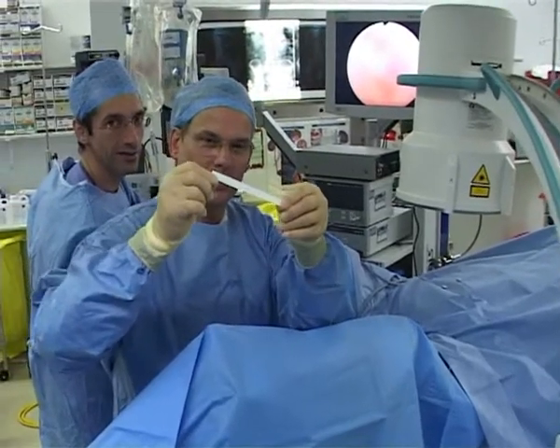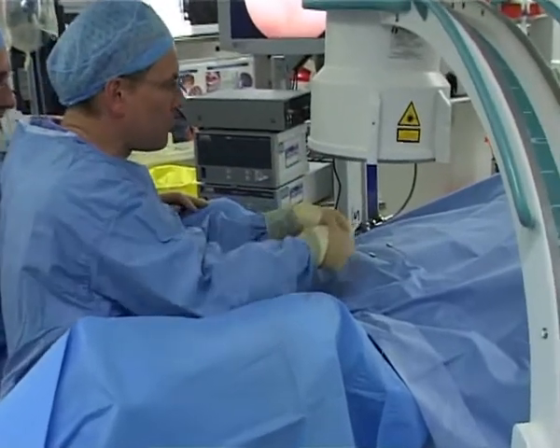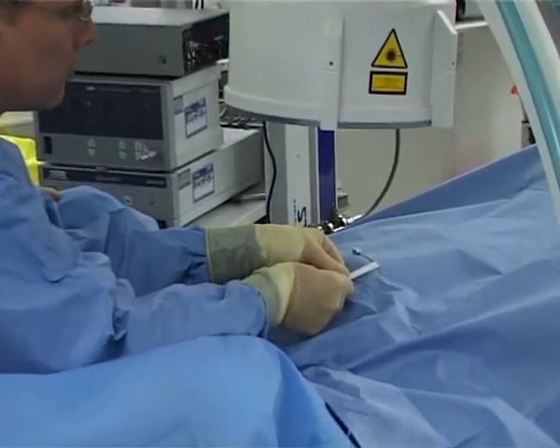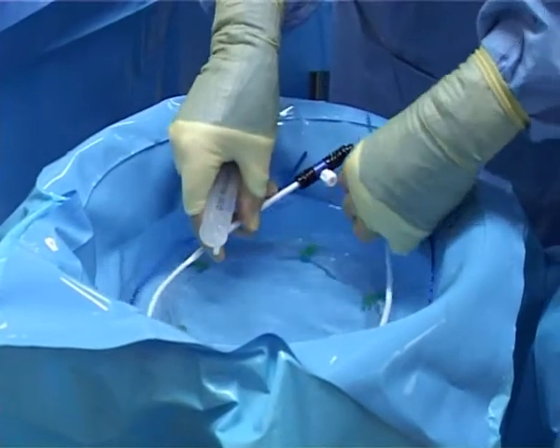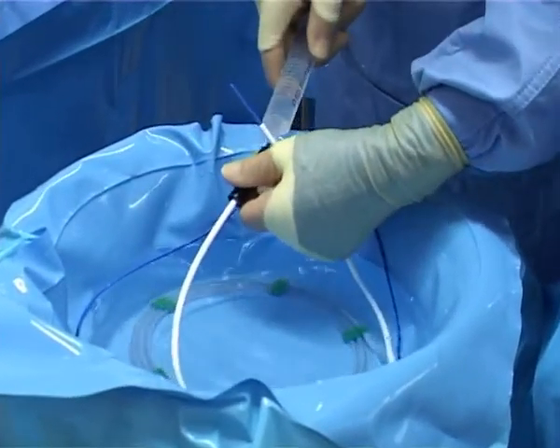The distance between the 2 needles is measured with a sterile measuring tape. Stent length should exceed this distance. Care should be taken to flush and wet all equipment prior to use.